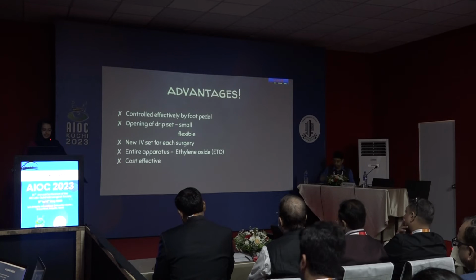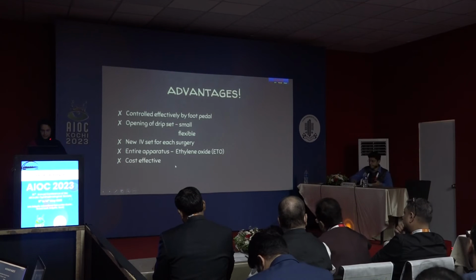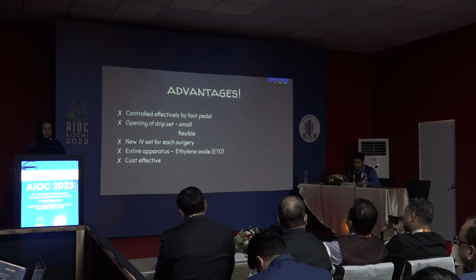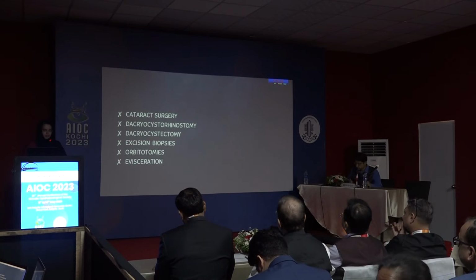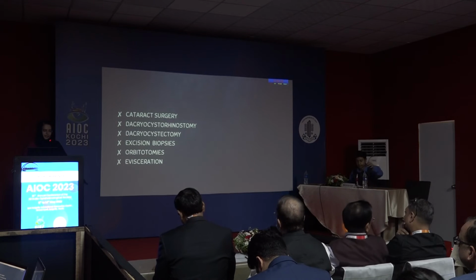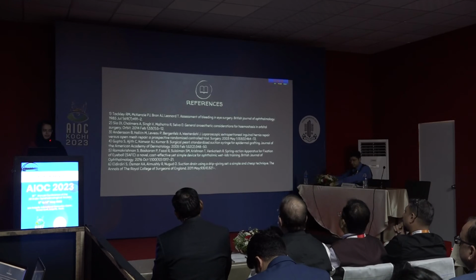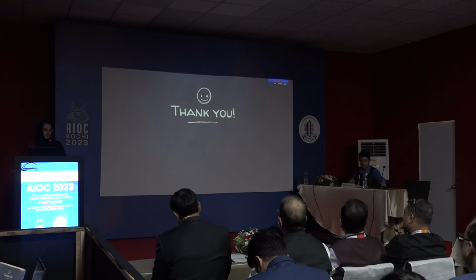And the entire apparatus can be sterilized by ethylene oxide, and it is cost effective. The cost of the entire equipment is less than 1,500 rupees. And it can be used for surgeries like cataract surgery, dacryocystorhinostomy, dacryocystectomy, excision biopsy, orbitotomy, evisceration. These are my references. Thank you.